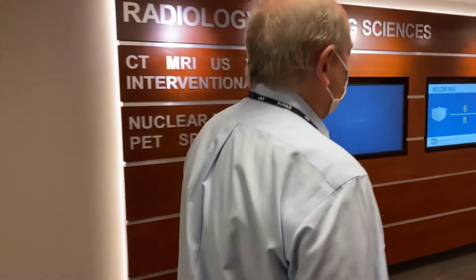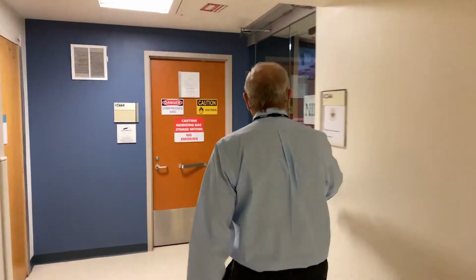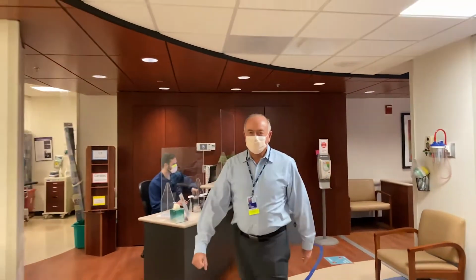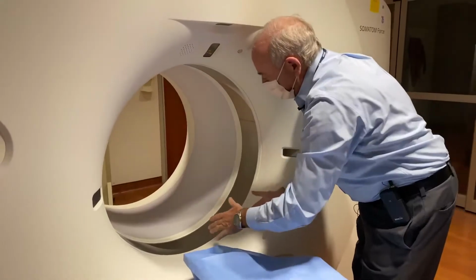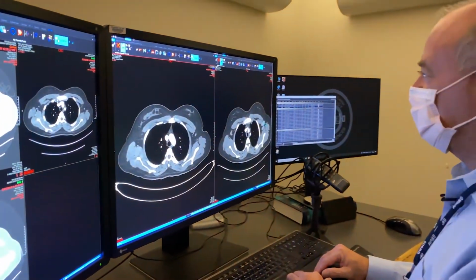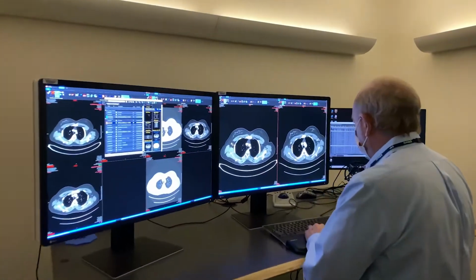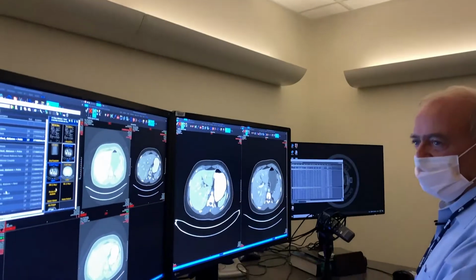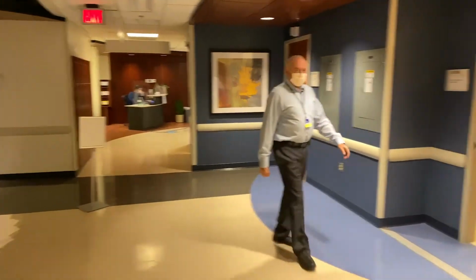Dr. Folio is a senior research physician and the lead computed tomography radiologist at NIH Clinical Center. He will provide an overview of our radiology preprocessing (RP) integrated workflow curriculum that includes image acquisition such as computed tomography or CT and PACS, otherwise known as Picture Archiving and Communication Systems. PACS is used to view medical images and includes highly advanced processing tools that produce multiplanar reformation, 3D imaging, and lesion management applications.